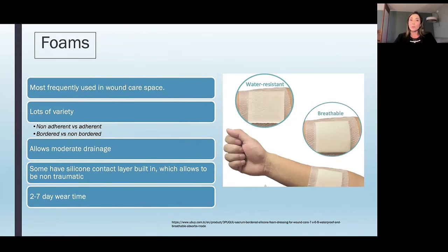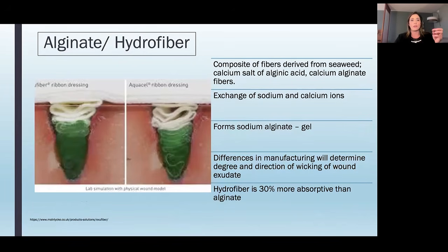And you can get anywhere from a 2 to 7 day wear time out of these. You can even peel back the ones that do have the silicone to check the wound and then push it forward. And they're also used for prevention of wounds, particularly in pressure injury care.